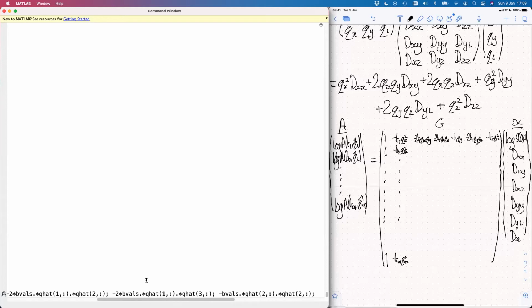So then the dyz. And finally, the dzz column.